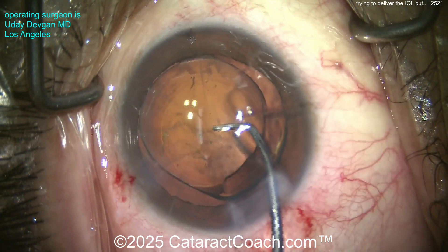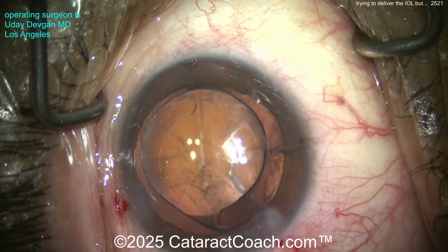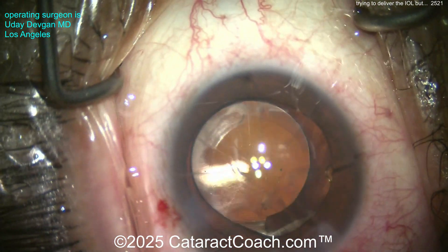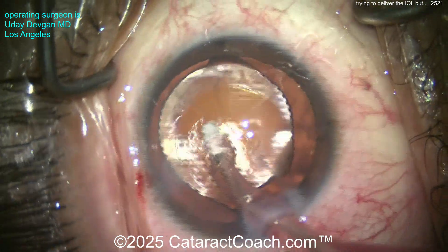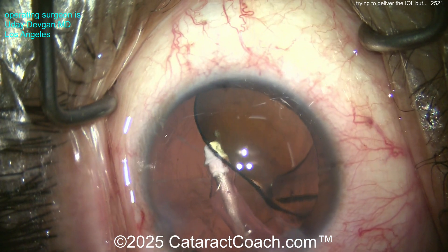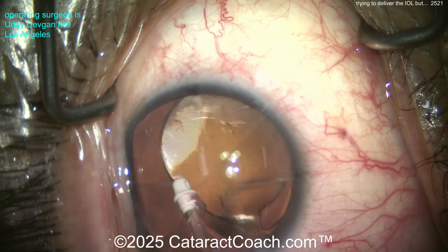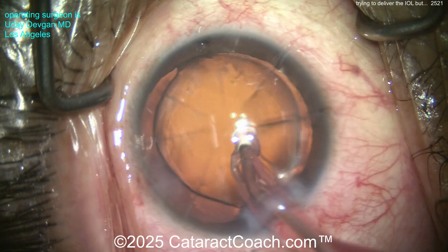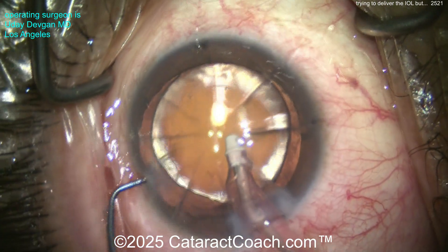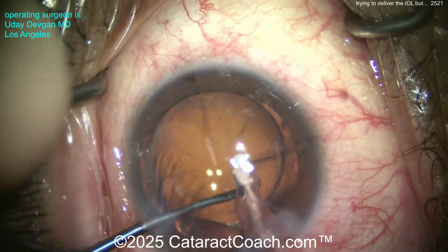RK cuts — radial keratotomy cuts — are at least 90% depth. Back in the old days when people did RK, the idea was to go to literally almost 100% depth. If you had micro-leaks or micro-perforations from the incisions, they thought it was great because it made the corneal flattening far more effective. So think about that: at least 90%, if not very close to 100% depth on those incisions.